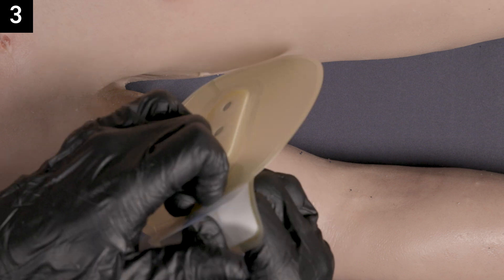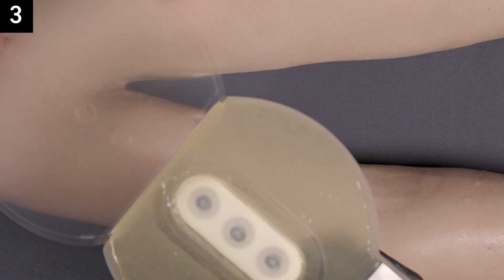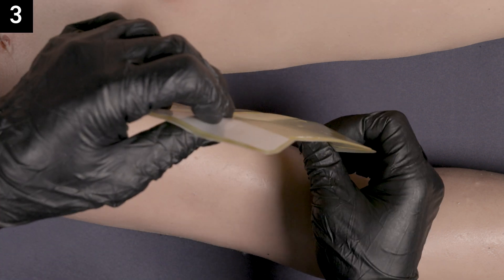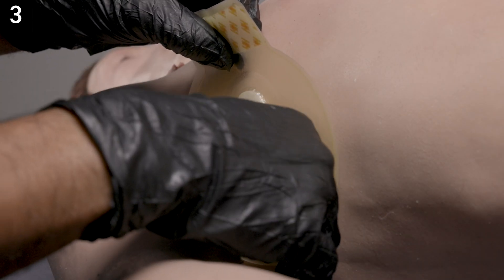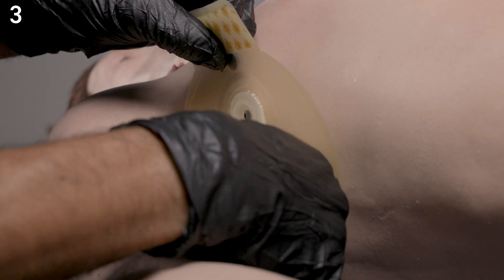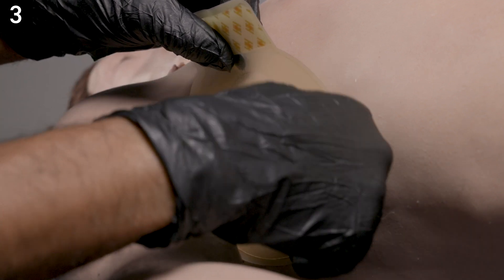Step three: remove the adhesive liner and apply the seal to the wound. Securely adhere all adhesive edges.